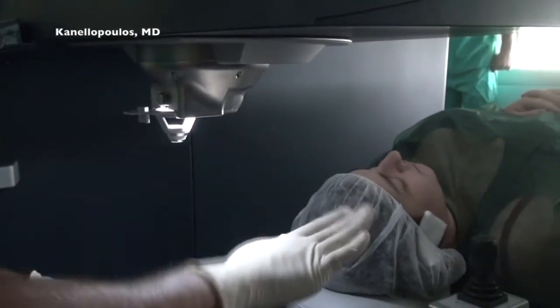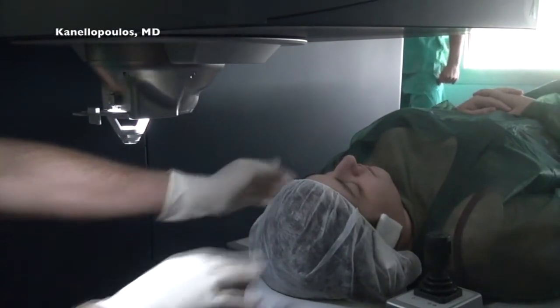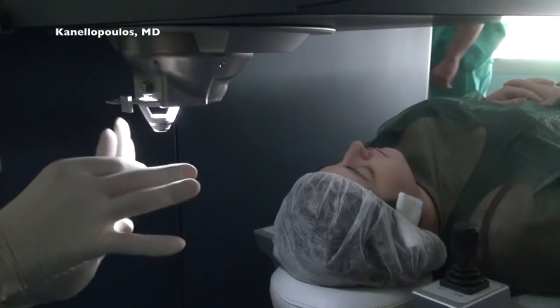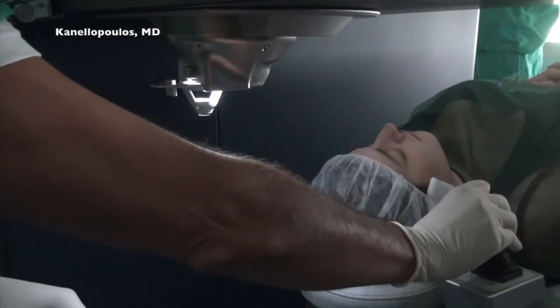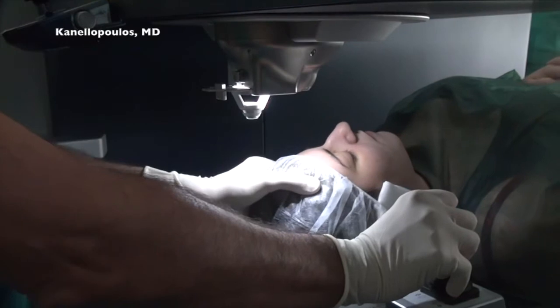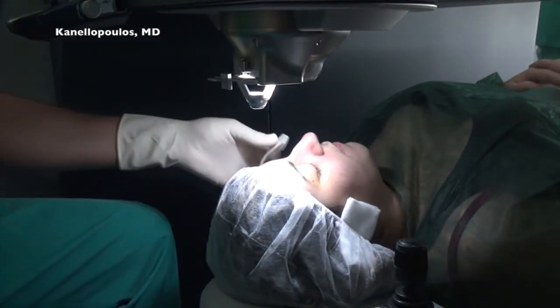We've reported in the past in the peer-reviewed literature several of the advantages with this femtosecond laser and its extreme accuracy in flap creation. Here I'm going to adjust the head position in order to have the cornea level as horizontal as possible. I was able to drop the headrest a little bit and bring the head into a more comfortable position for this particular patient, but also more horizontal. So thus the femtosecond laser PI will come down in a vertical fashion. This is very important. I know some of these may sound redundant for experienced LASIK surgeons, but for the beginning surgeon, these are very important points.